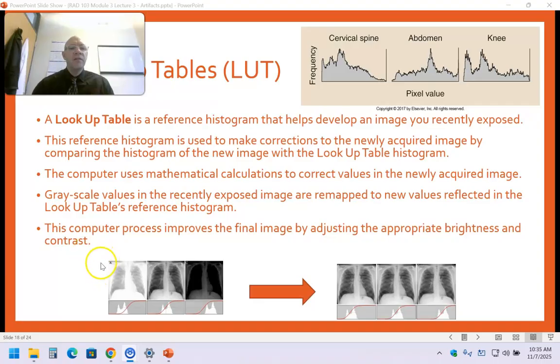So if all of our values are a little bit light, everything is too white, then it could just say, just add, I don't know, 10 points or 20 points or 1,000 points to each pixel value and make it darker. And it does that.